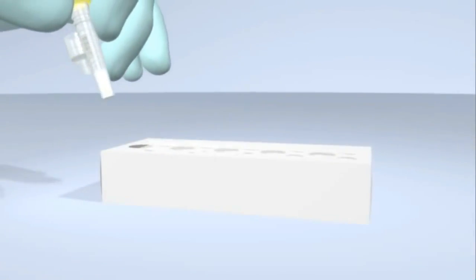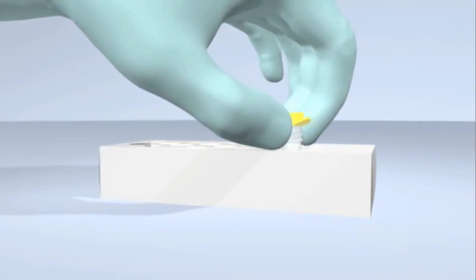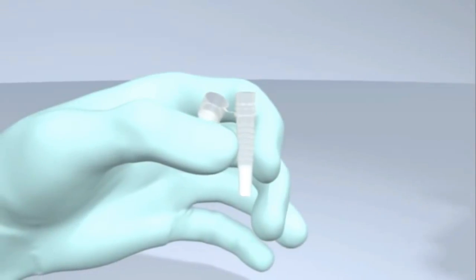Place the labeled unitized tube or tubes in the designated area of your workstation or rack until you are ready to process the sample. After obtaining the proper nasopharyngeal or nasal swab specimen, securely hold the tube in one hand while twisting and pulling straight up with the other hand to remove the cap.